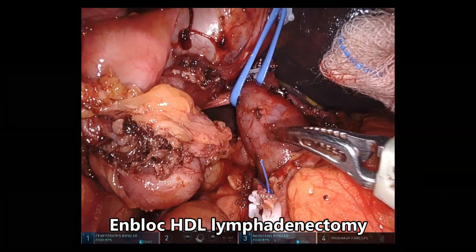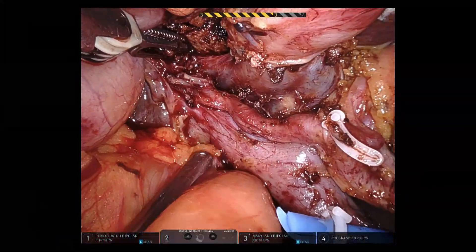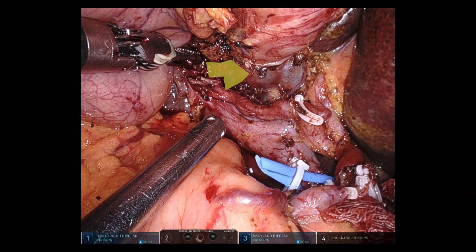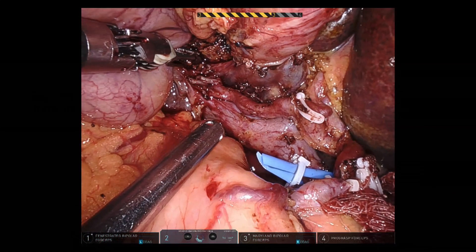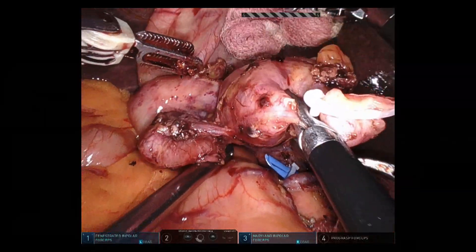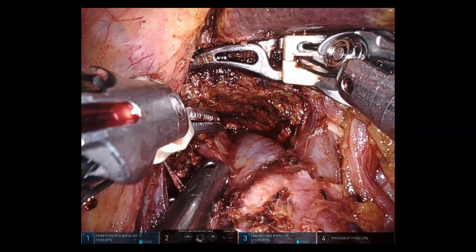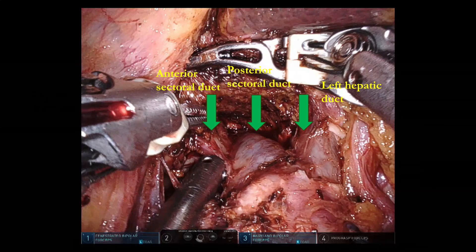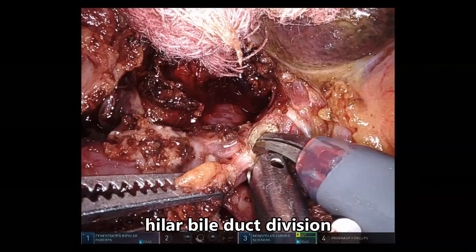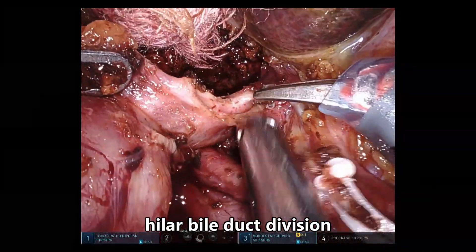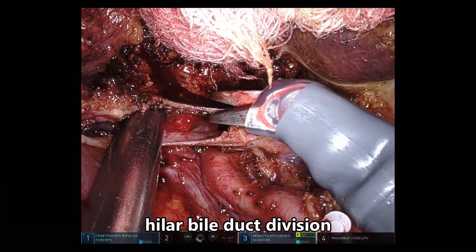En-bloc hepatoduodenal ligament lymphadenectomy is completed. We can clearly observe the hilar bile duct formed by the confluence of the segment 5/8 anterior sectoral duct, the posterior sectoral duct and the left hepatic duct. The same structures can be viewed from the anterior aspect. The hilar bile duct is divided, and we can observe white bile in this patient. It is critical to send both lower and upper biliary margins to confirm R0 resection.